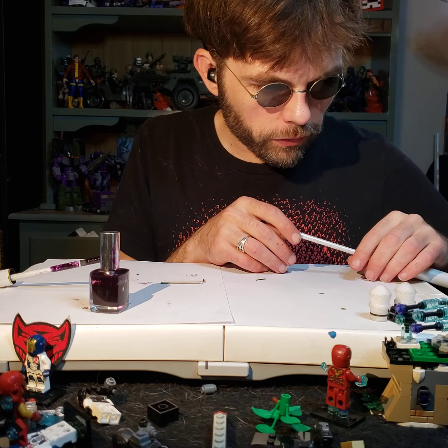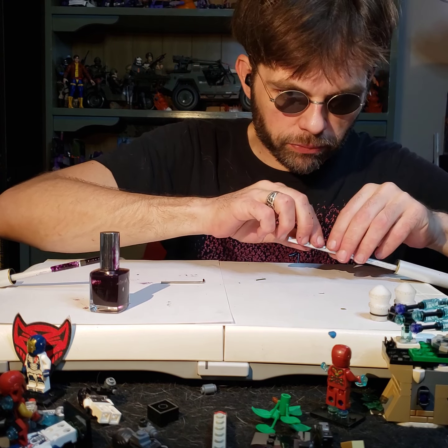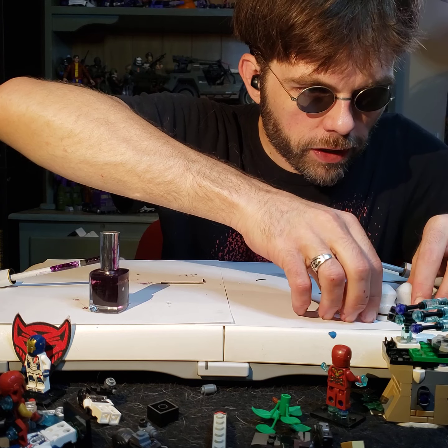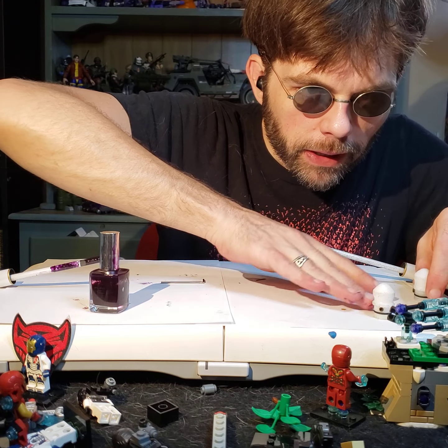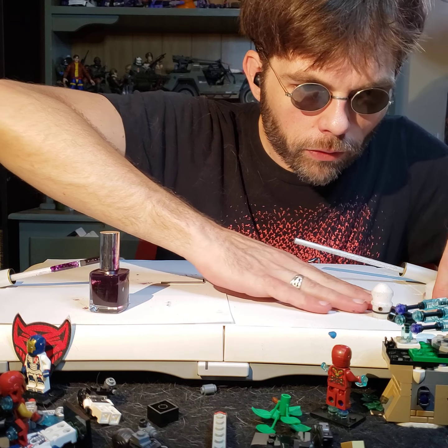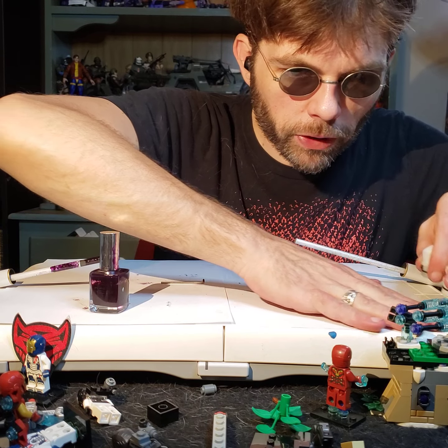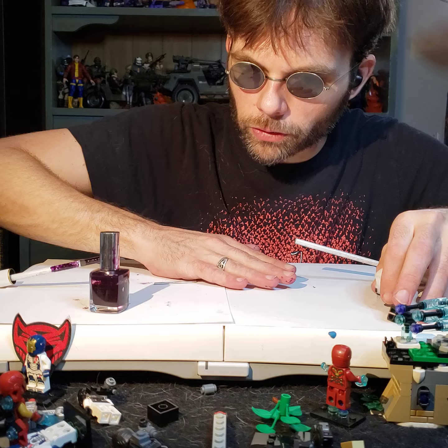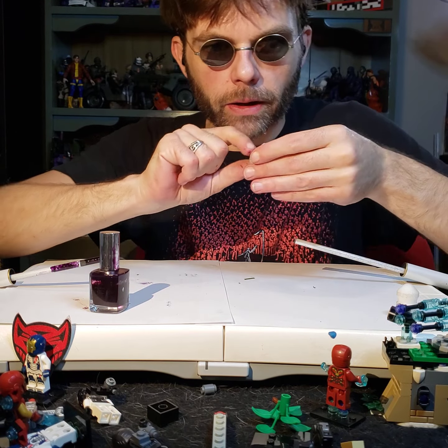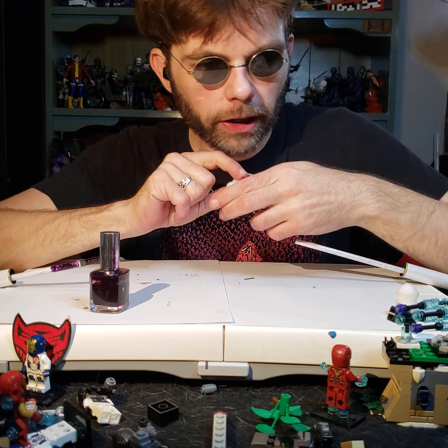Now we're going to set it back over here, but now instead of the red bit sticking out, we've got the white bit sticking out. Let's find ourselves the tip. Here's just the tip. And where is my Allen wrench? Uh-oh, I didn't do what I was supposed to do. See, this is why I told you, put the Allen wrench back where you put your tips, or else you'll lose it. And I found it, luckily.